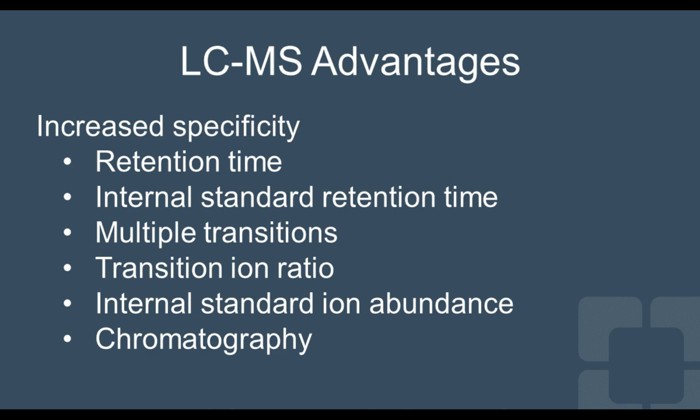You have an internal standard that can be added. An internal standard is often an isotopically labeled analog of your analyte of interest, maybe replacing the carbons with carbon-13s or replacing the hydrogen with deuterium atoms. This should have very similar characteristics with LC mass spec methodology and have similar, if not the same, retention times. Also, you can monitor multiple transitions, which we mentioned earlier, with the blue dot breaking into potentially a rectangle, and a Pac-Man can be monitored.